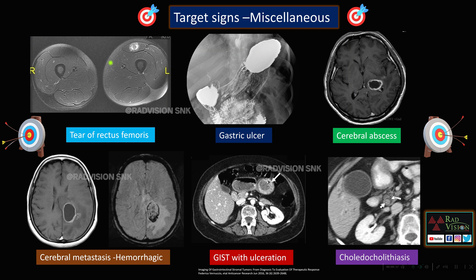Miscellaneous target signs include: tear of rectus femoris showing a target pattern; gastric ulcer showing target pattern; cerebral abscess showing target pattern; cerebral or hemorrhagic metastases showing blooming on GRE with target pattern; GIST with ulceration showing target pattern; and choledocholithiasis where a hyperdense bile stone surrounded by hypodense bile gives a target sign. Other target signs can be seen in subacute hematoma, Lyme's disease, and sonographic target sign in neurofibromas or schwannomas.